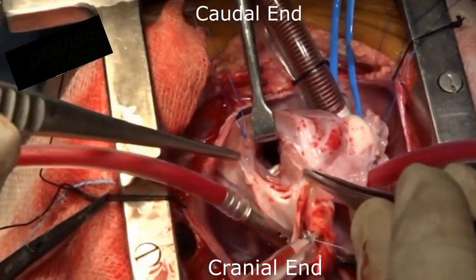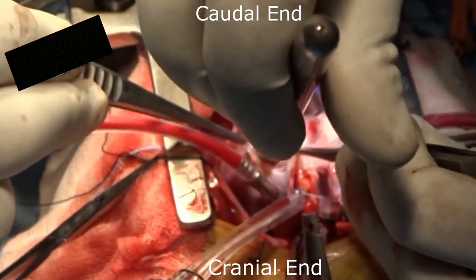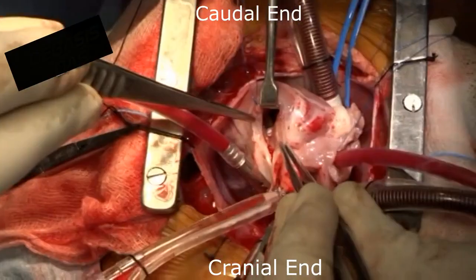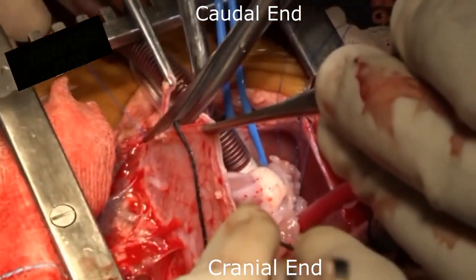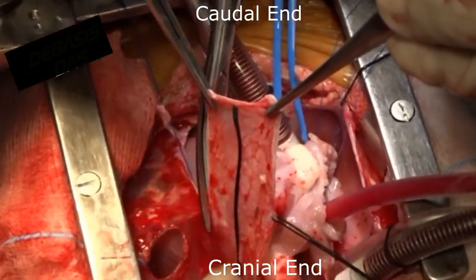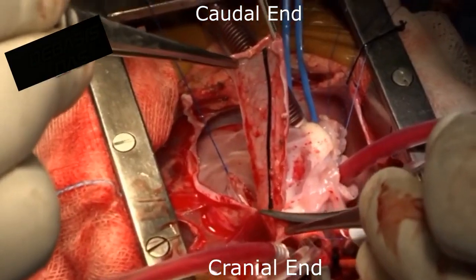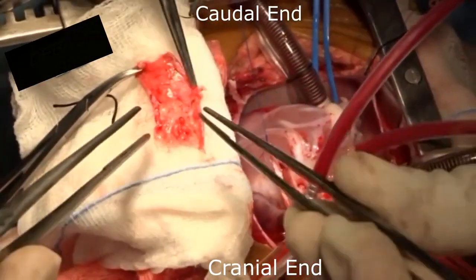This is again a view from the top, and the cranial and the caudal end in the video are marked. The RVOT is assessed with an appropriately sized Hegar dilator. We can see the VSD patch through the ventriculotomy, and an appropriately sized autologous untreated pericardial patch is fashioned to augment the right ventricular outflow tract. In this particular case, we did not use any valve in the RVOT.